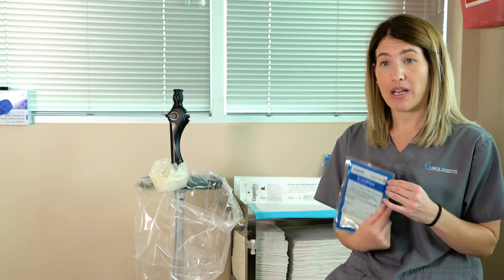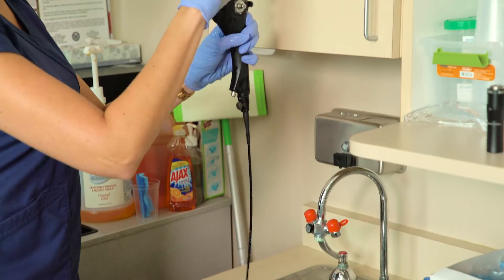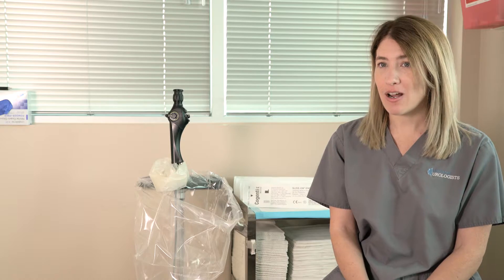You wipe the scope down with the EndoWipe — it's an enzymatic wipe. You just wipe it down and then clean it with alcohol after you flush it. The scope is always ready, so if there's an emergency add-on that we need to add to the schedule, the scope will be ready and we don't have to wait for it to be disinfected.